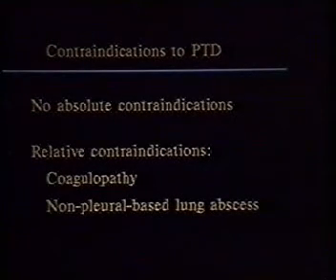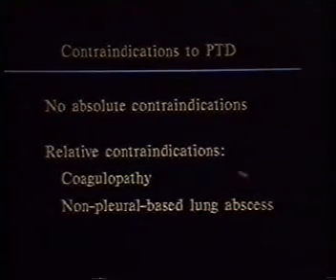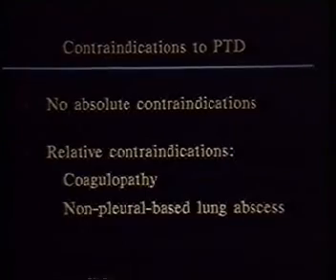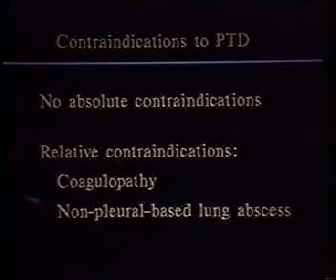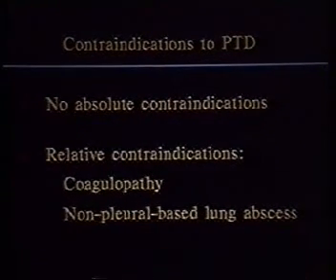The contraindications to this procedure are really limited. There are no absolute contraindications to the performance of this procedure, but in patients who have underlying coagulopathy, whether it be due to thrombocytopenia or liver disease, which is not uncommon in our county population, we tend to try to correct these factors prior to undertaking the procedure.